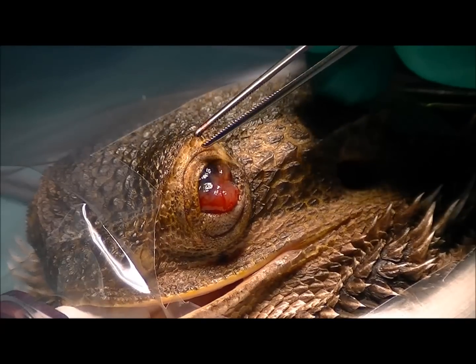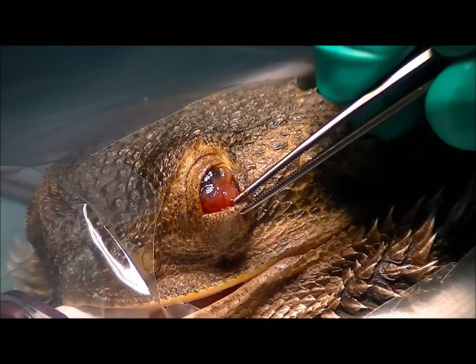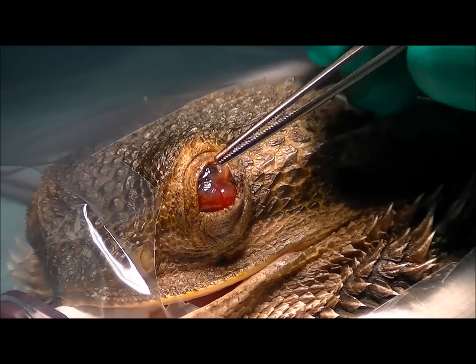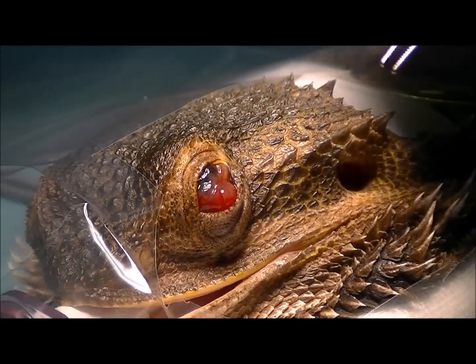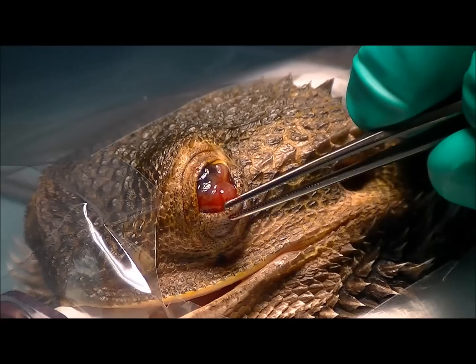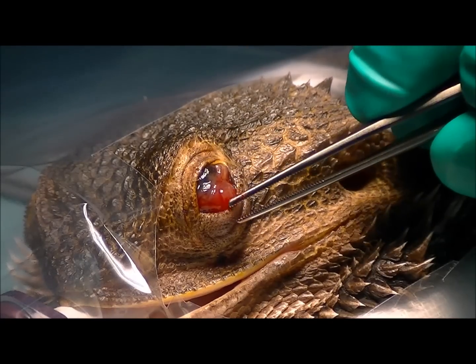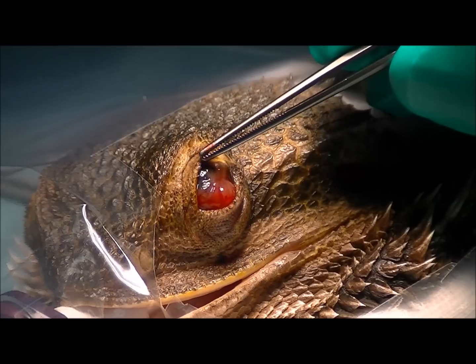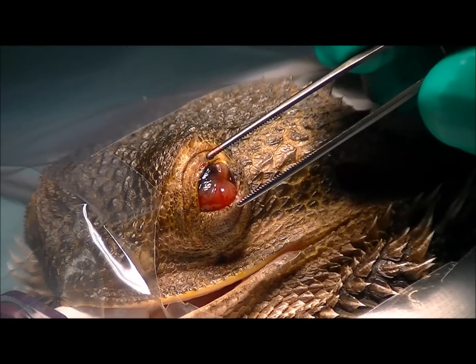The first stage of eye removal — there are a couple of different techniques. The technique I use is to stitch the eyelids shut first, then make an incision around the outside, go down behind the eye, and take it out. I'm hoping we'll be able to preserve the third eyelid — we might be able to make a flap to cover the hole and make it look a bit more cosmetically nicer. So we'll stitch these eyelids shut and then come back and start the incision.